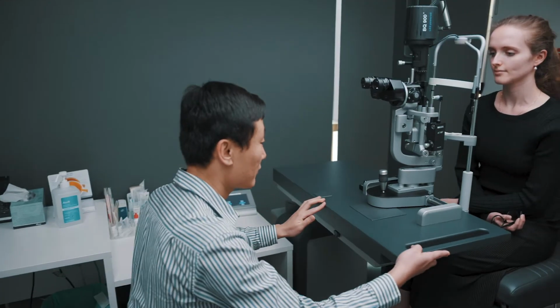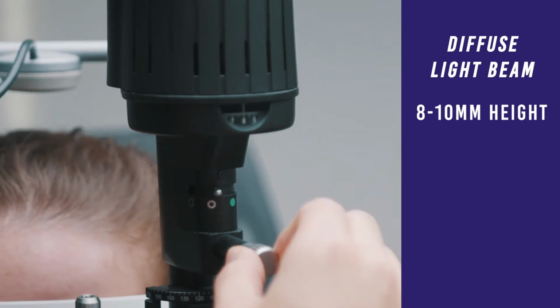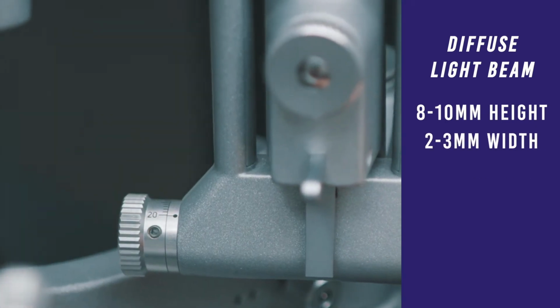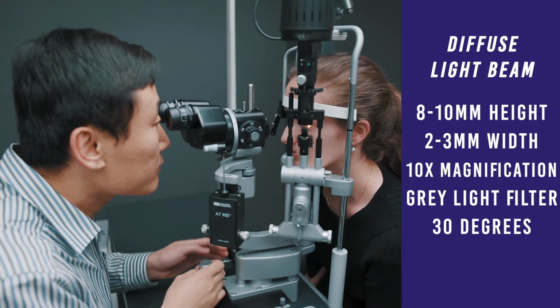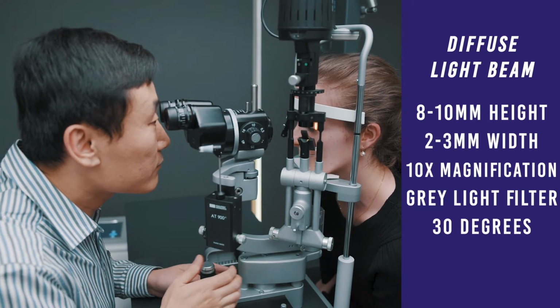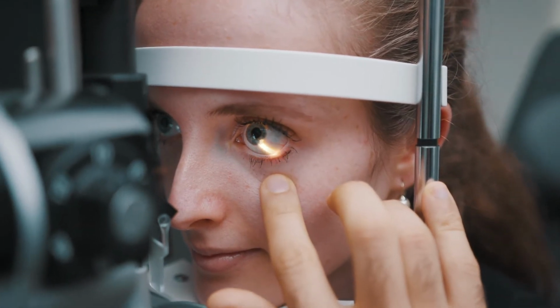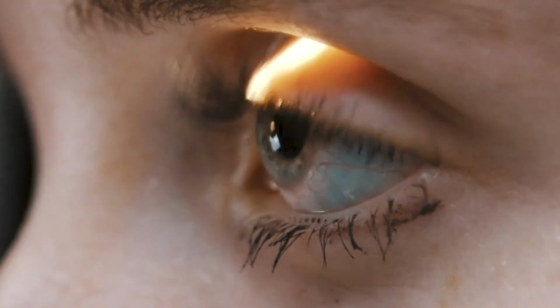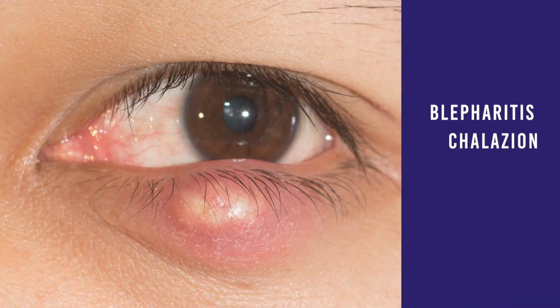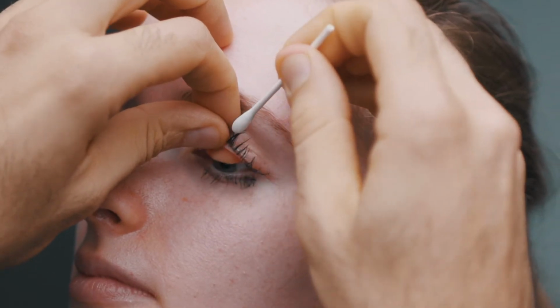So first you want to examine the lids and lashes. Here use a diffuse light beam which is 8 to 10 millimeters high, 2 to 3 millimeters wide with 10-fold magnification and the grey light filter on. Angle the illumination column to about 30 degrees and then scan from side to side, looking at the medial canthus, upper and lower punctae, the eyelashes, lid margins and across to the lateral canthus. Common abnormalities here include things like blepharitis, chalazions and papillomas. You can also evert the eyelids here if it's indicated.